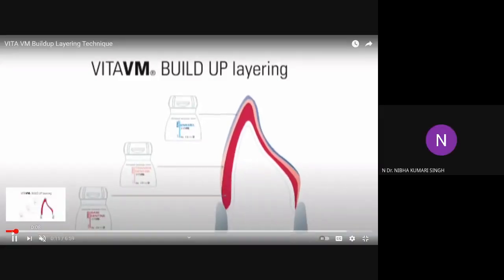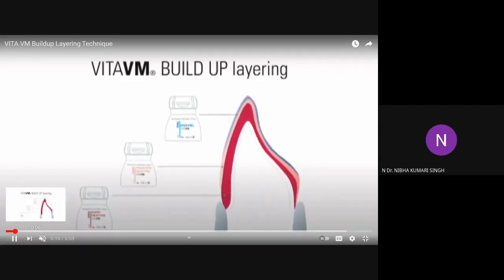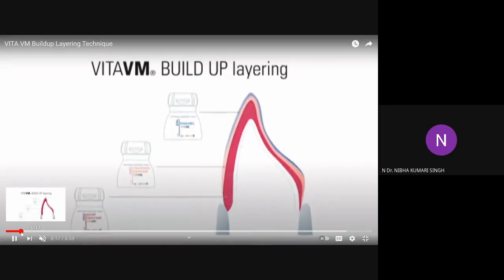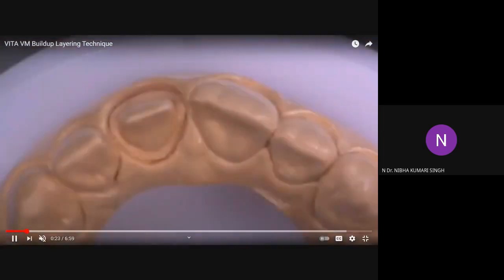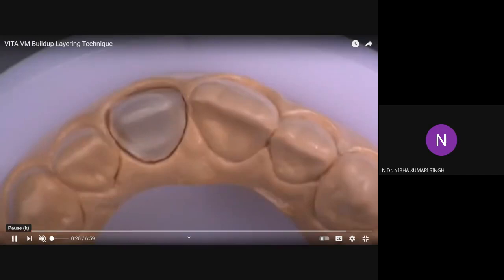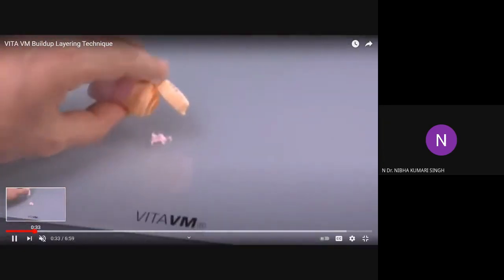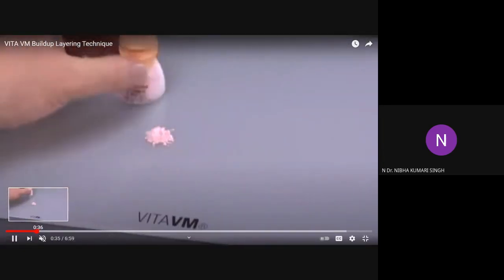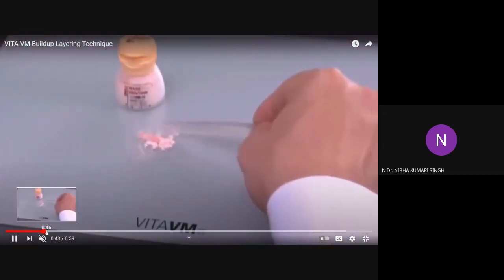So you can see how the layering is done in the Vita build-up layering method. Actually, this is there in our lab also, with the Vita furnace. You can see on this normal die they are going to do the ceramic build-up. Beautifully they have shown how to apply the opaque porcelain and body porcelain, the ceramic powders, and the special liquid which is given along with the ceramic powders.